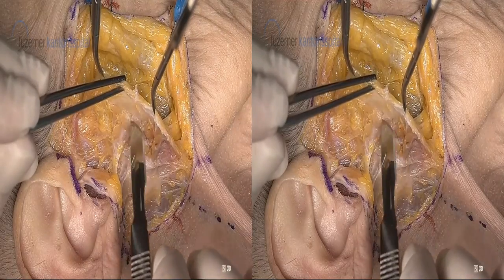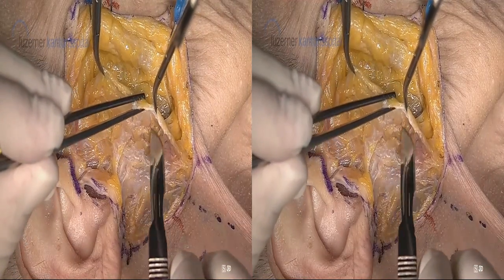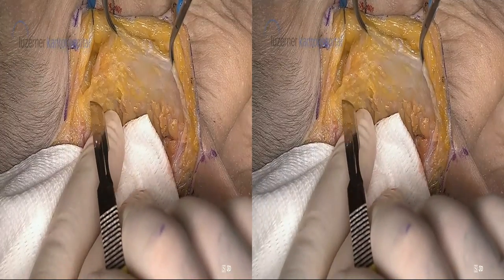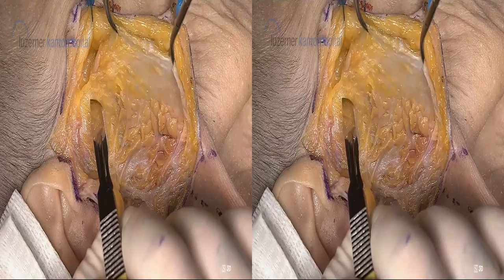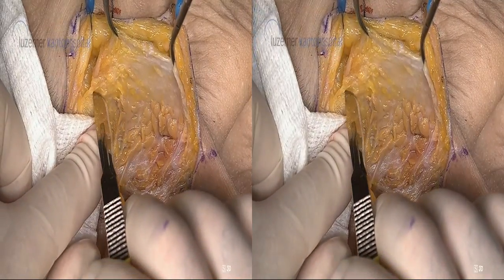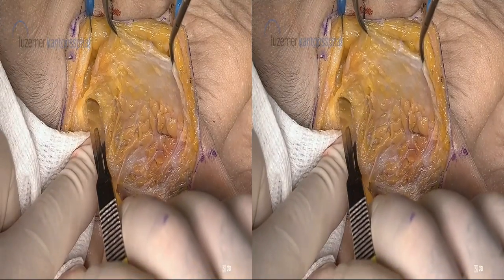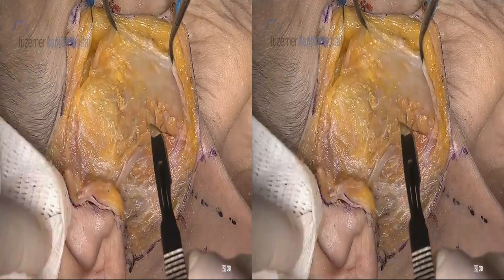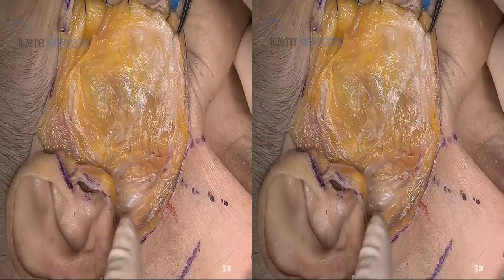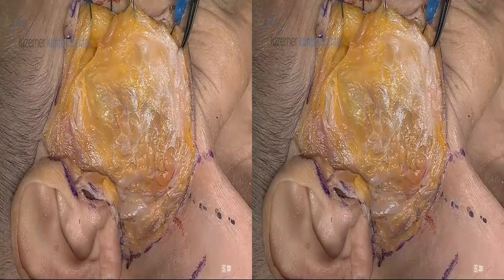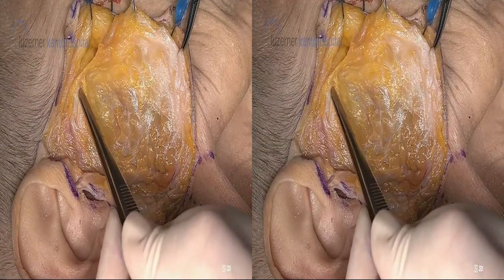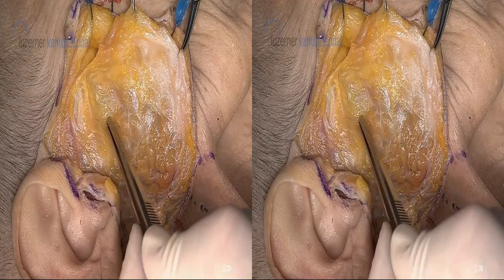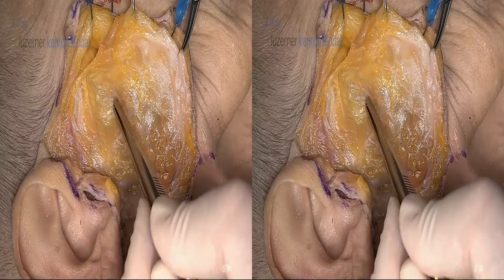But you see here nicely the parotid capsule and parotid tissue here. We can dissect this SMAS flap anteriorly. Now here is already a nerve — this could be the frontal branch. You see here, this is a small nerve just underneath. So we are aware that dissecting here in the fat tissue, we already see branches of the facial nerve because we are outside the parotid gland. This is the articulation here. So we expect the nerve to come out underneath, medial to the zygomatic arch, and to run about in this direction. This is the mandible, the head of the mandible, the articulation, and we expect a nerve down here.